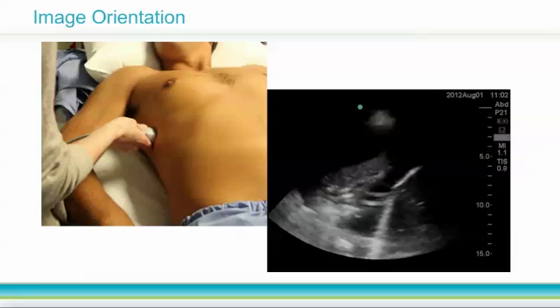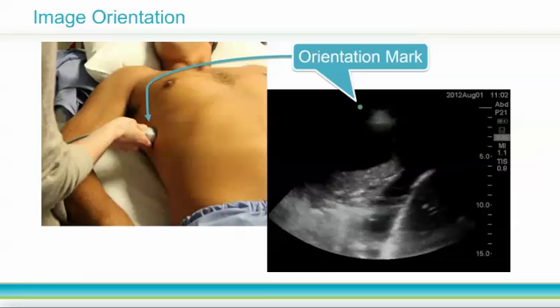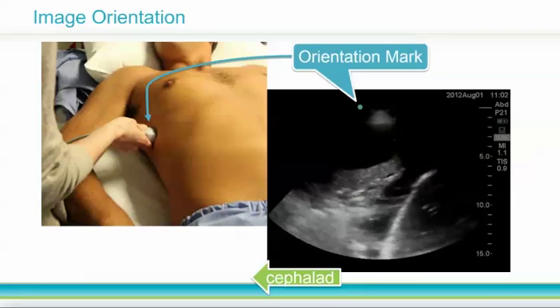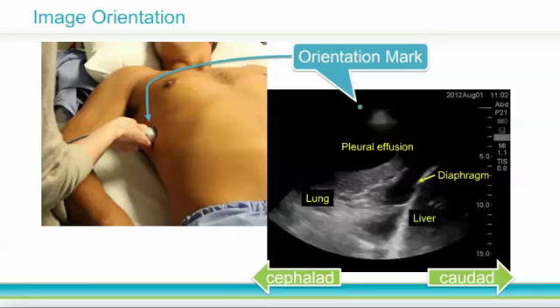For other exams, instead of left and right, you will use a cephalad-caudad orientation. Here, the transducer marker is pointing to the patient's head, so the left side of the screen — where I see the orientation marker — is cephalad, and the right side is caudad, or towards the feet. This helps me understand the anatomy I see on my screen. The lung, which can look very like liver when it's consolidated, is cephalad, and the liver is caudad.